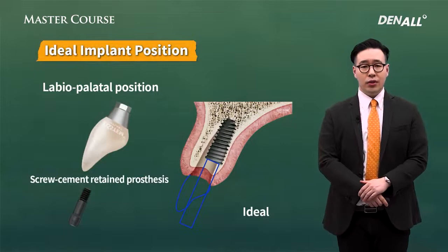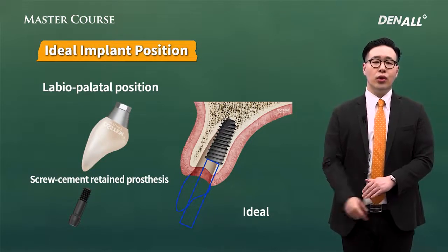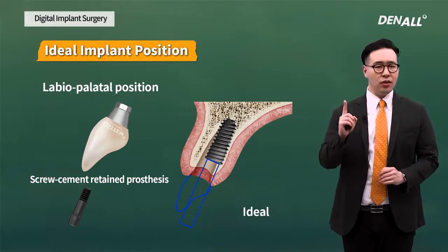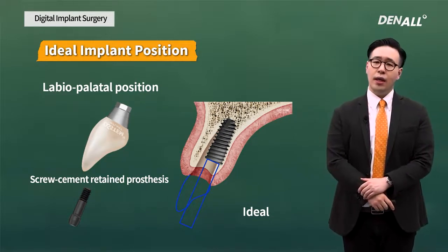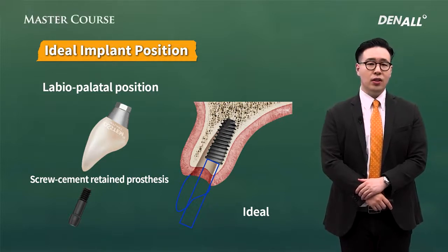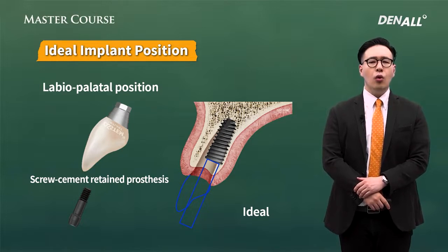However, as you can see, if you use guided surgery, on the program, after the final prosthesis appearance is rendered, ideal positions in terms of prosthesis and surgery can be visualized. And if they are not merged properly, the final implant positions can be determined in the next best positions.